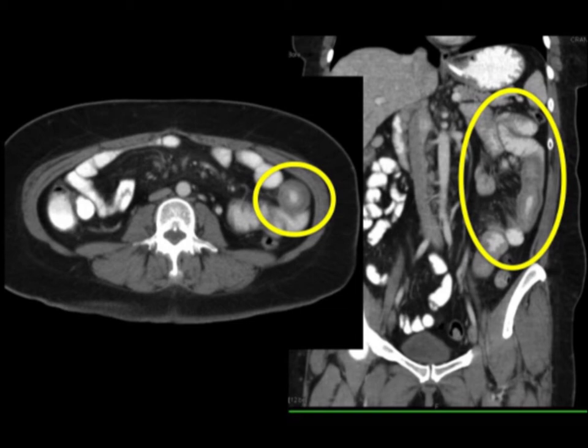Crohn's is more narrowing, perhaps, whereas here the whole bowel is edematous. This is also a nice case to show the value of positive contrast material — very nicely shown here. We would have seen changes in enhancement with neutral contrast as well, but it's very nicely demonstrated.